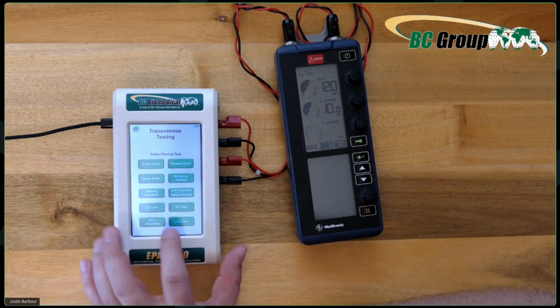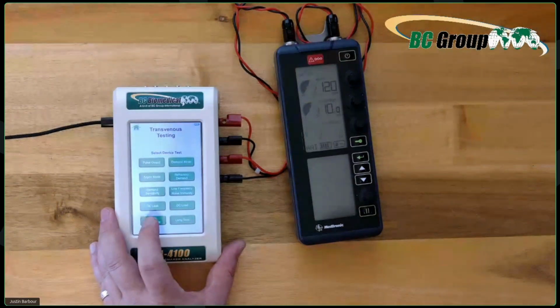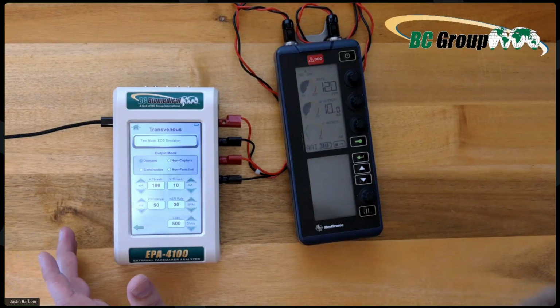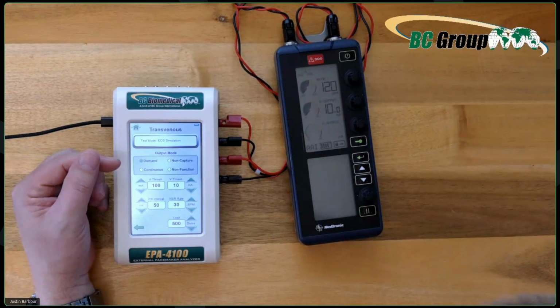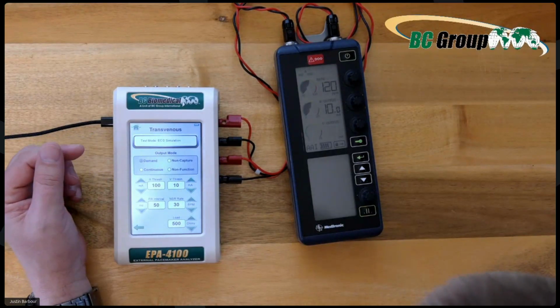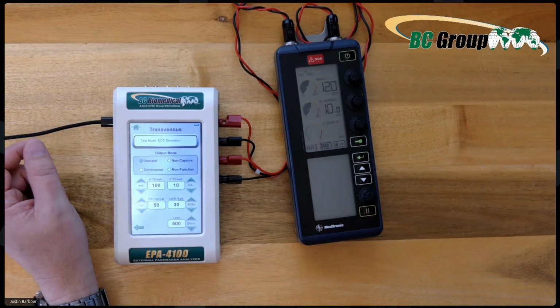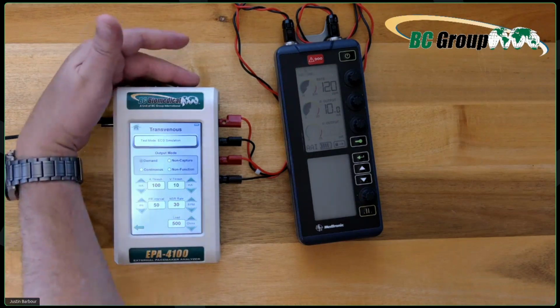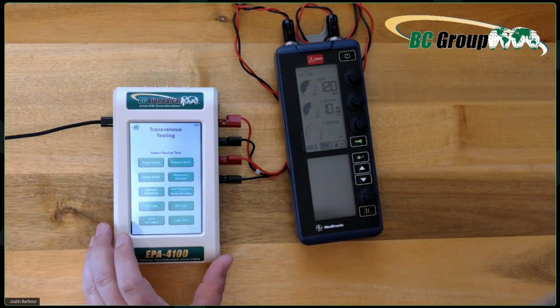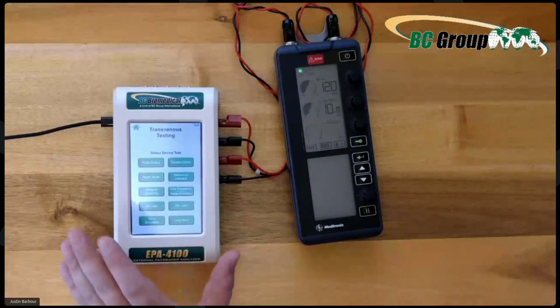We have DC leak, DC load. I'm not going to pretend like I know what those are at this time. I'll do more videos on them in the future when I get a little more information. It is what it is, guys. Over here, we've got demand, non-capture, continuous, non-function, and this is for the ECG mode. Again, I have not done anything with this, and I don't have any ECG cables anyway to test out, so it is what it is. I'm just showing you guys the various screens associated with this analyzer.